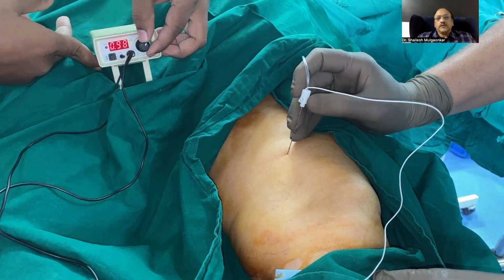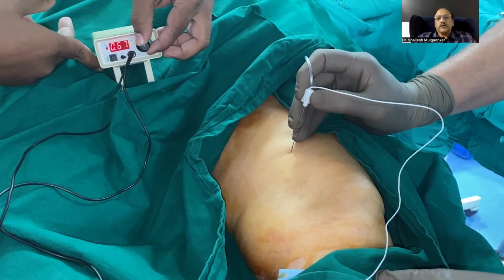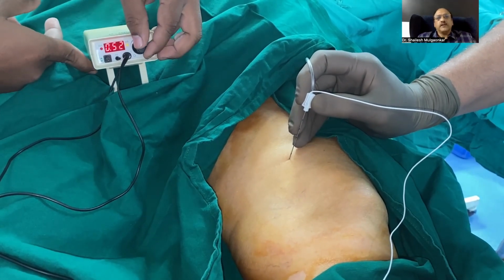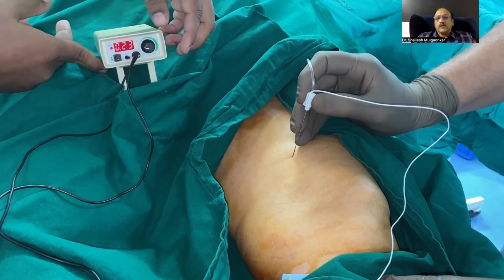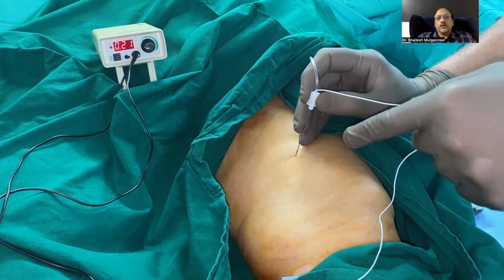Keep on reducing the current to 0.5. The end motor response should continue. The twitches of the vastus medialis should continue. At 0.5, they are continuing. Then reduce to 0.2. The end motor response should disappear. You can see at 0.21, it is gone.